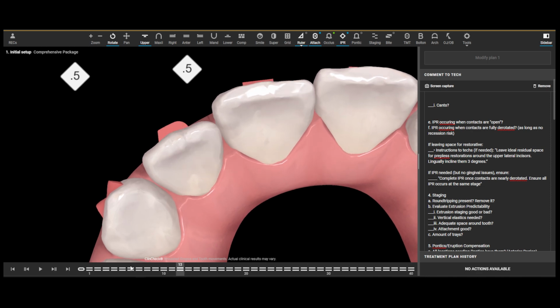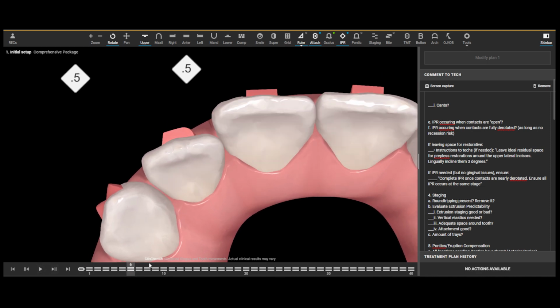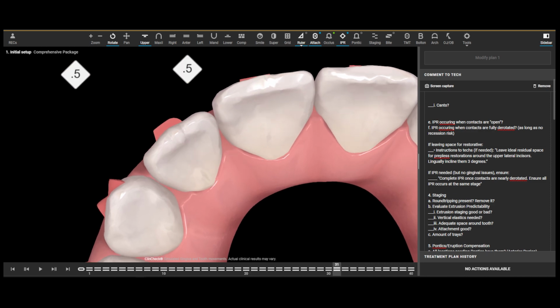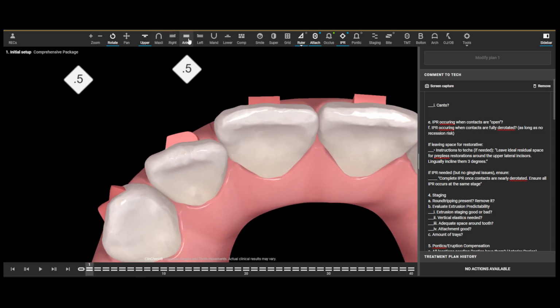So they've waited a little long, to be honest here. Just make sure we're on the right screen. We are. They've waited a little long because I think they can do this IPR probably at like aligner number 30 now. The contacts are fine, but they've placed it at 36, which is fine. It's not the end of the world, but the main thing is that the contacts are derotated.